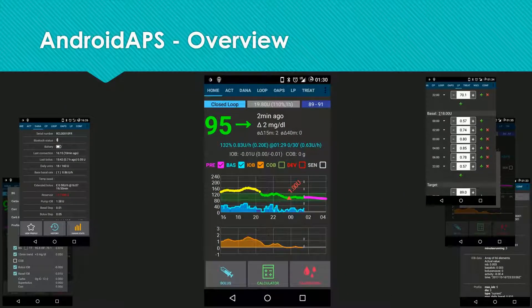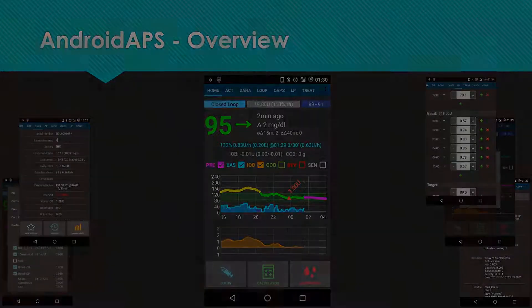Let's have a look at a typical interaction — like a bolus from a smartwatch.